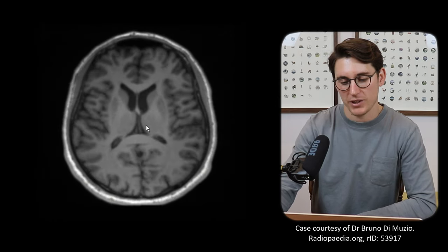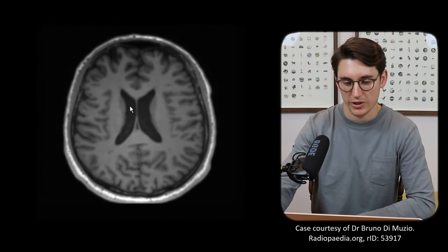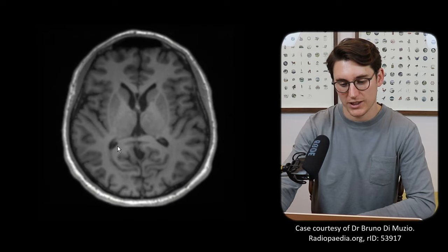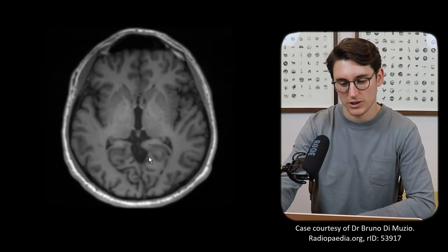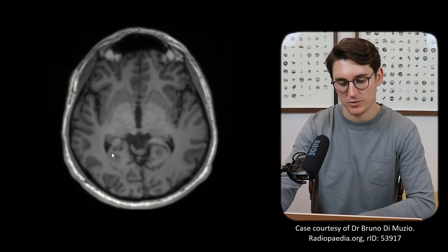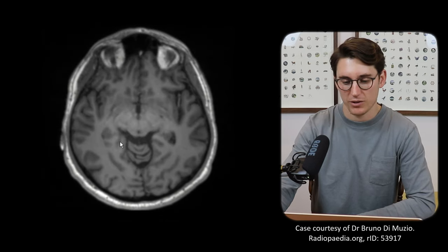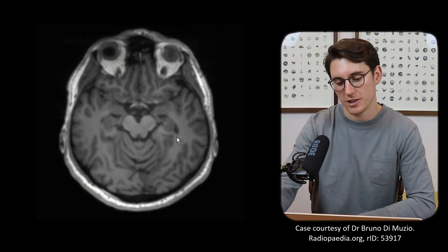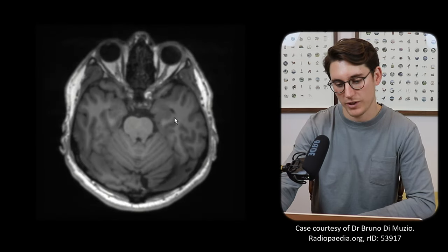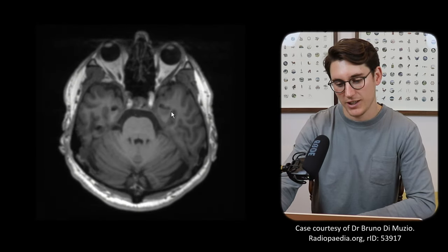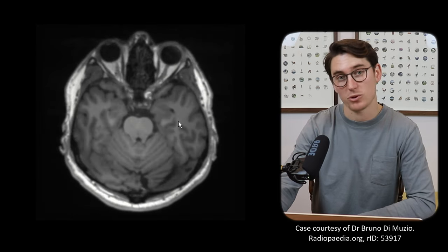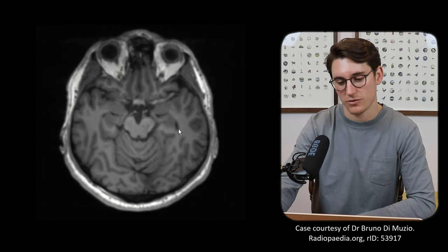Let's scan back up and follow this lateral ventricle down. We'll see it give off our occipital horns — small occipital horns in this patient — coming off backwards. Then following them further down, looking on the left hand side of the patient, we can see this comes all the way down into our temporal lobe. These are our temporal horns of the lateral ventricle.